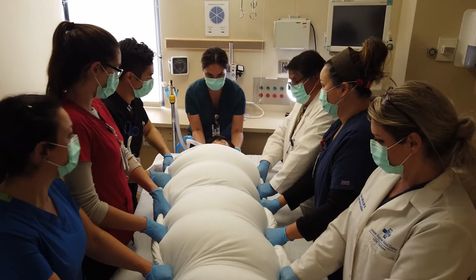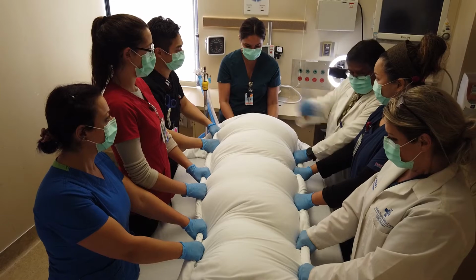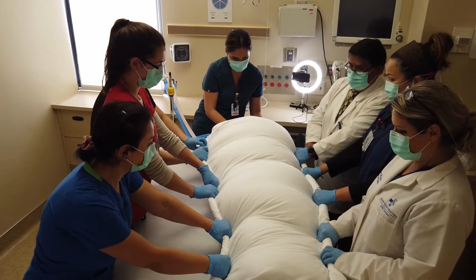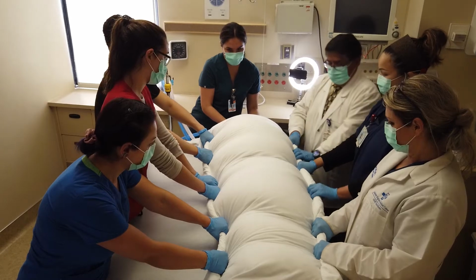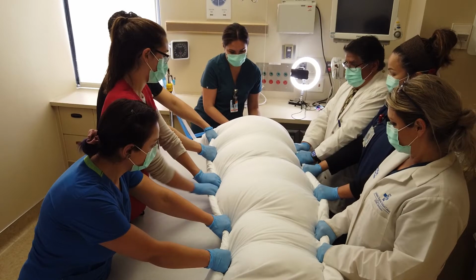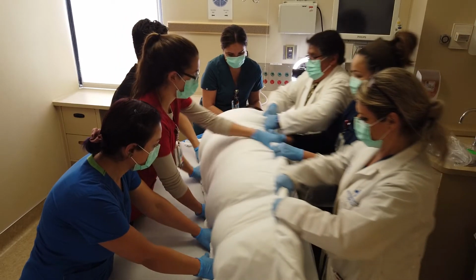The RT at the head of bed will count down to coordinate when the turners will slide the patient up and away from the ventilator prior to proning. During the turning phase, the turners on the ventilator side will push the patient in, underneath, while the turners on the opposite side will pull the patient up and towards the ventilator.